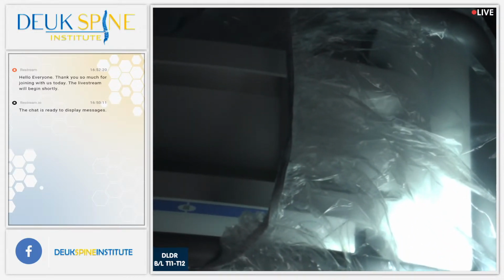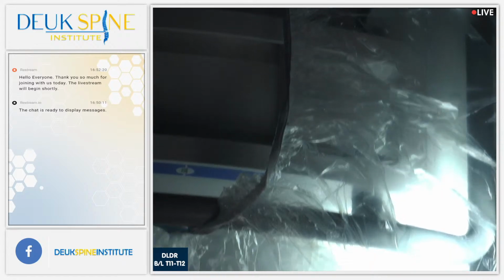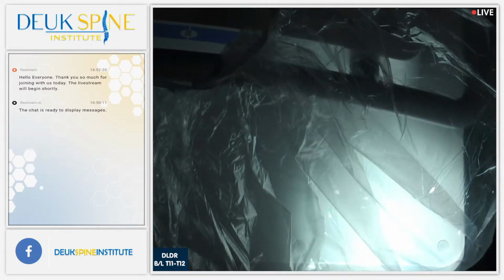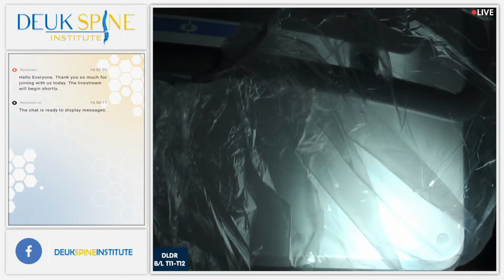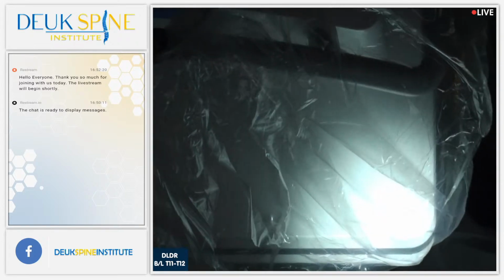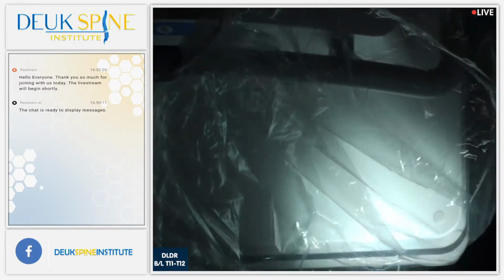We've done one side. I'm thinking about the cervical scope for the other. Can you open that, please? Because I think with the fracture being there, a cervical scope is better.